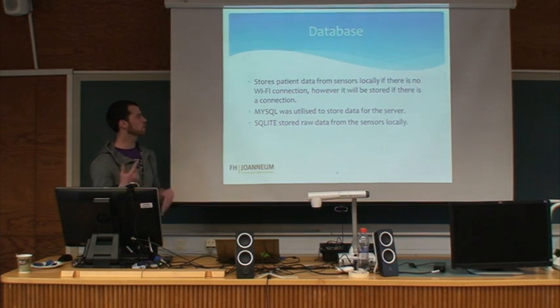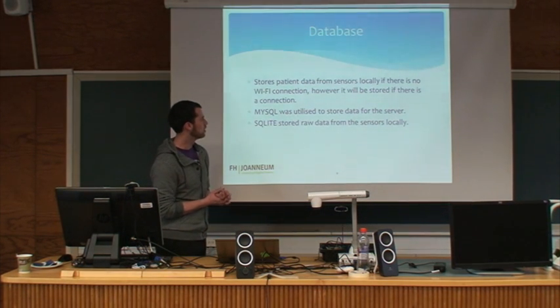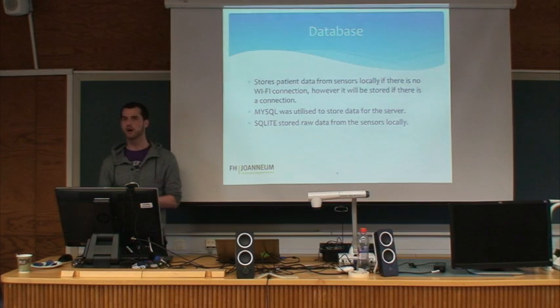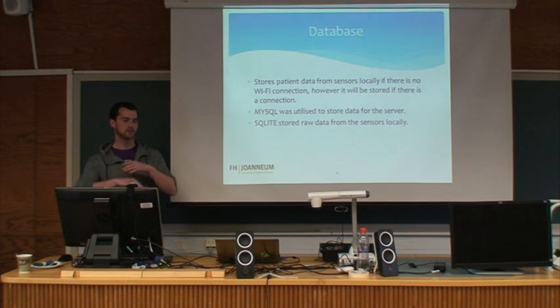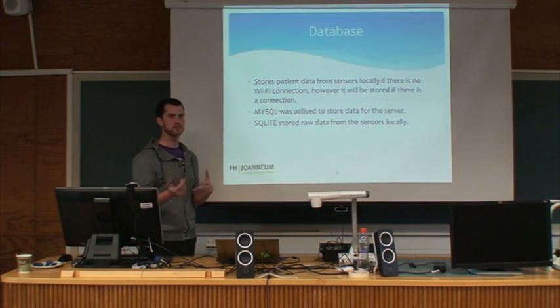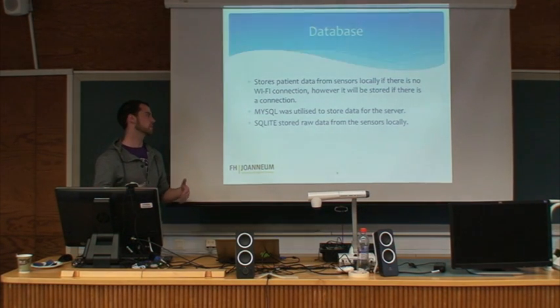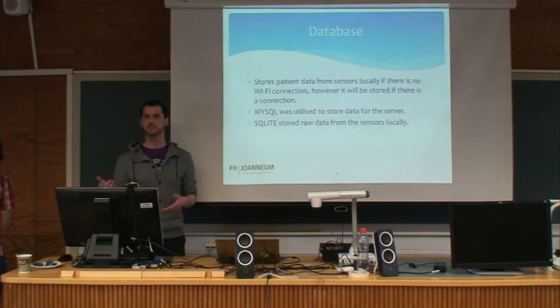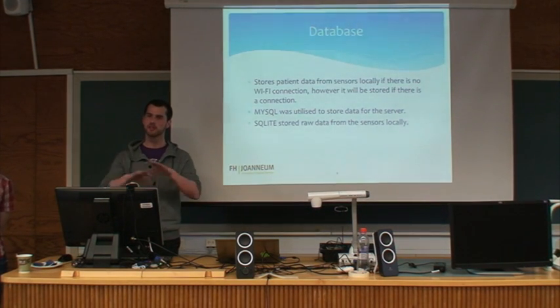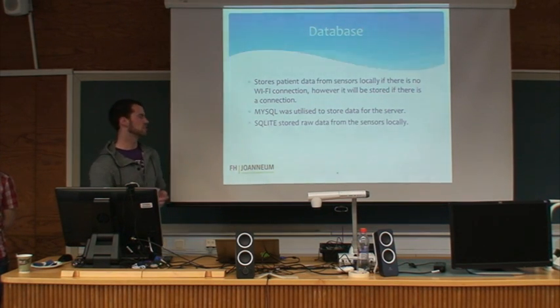Then, whenever we get a connection, at regular intervals we ping the server and synchronize with the main server. We also extended the model, so now we don't save each individual measurement anymore, but we introduced the concept of a measurement session. So we gather multiple measurements from different sensors, and in the future, if we had more time, we could extrapolate patient status from all that data and push it to the database so that the physician could see it.